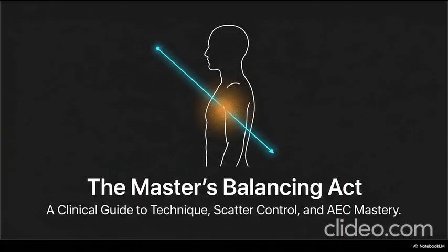And because mAs controls the total number of photons hitting the patient, it is the single biggest driver of patient dose. Just purely a numbers game. More photons simply equal more ionizing radiation absorbed by human tissue. Precisely. So mAs gives us the raw number of photons. That brings us to the second dial, kVp, kilovoltage peak.